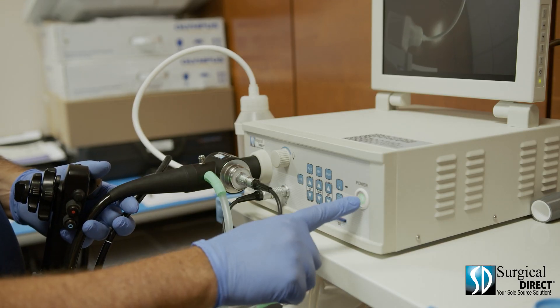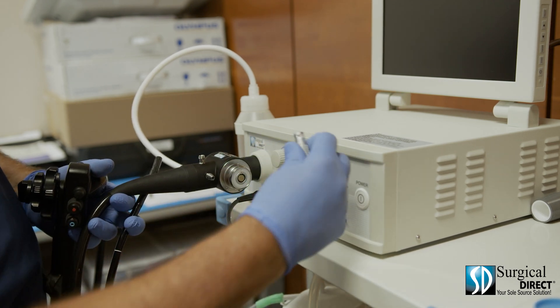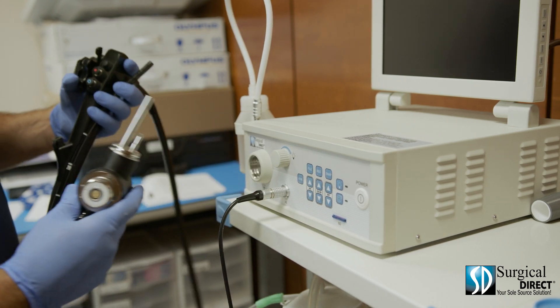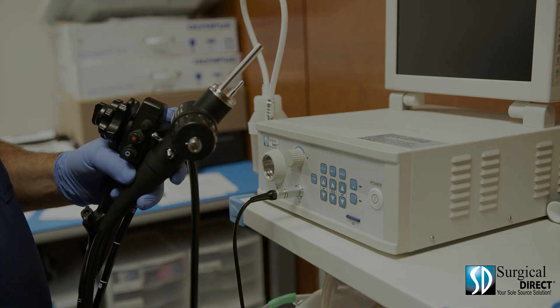To disconnect the scope, turn off the power, disconnect the suction hose, disconnect the video cable and water cable, and gently pull the scope out of the processor. Always place the soaking cap on the scope when it's not in use.